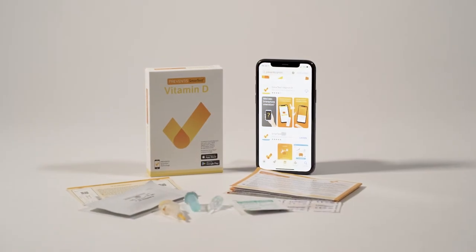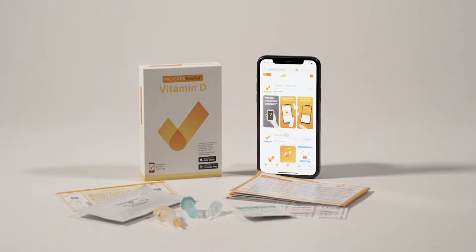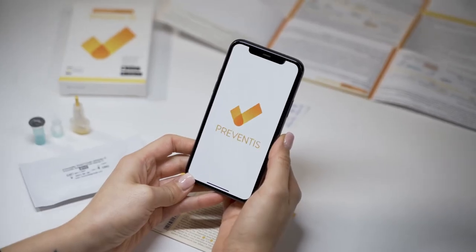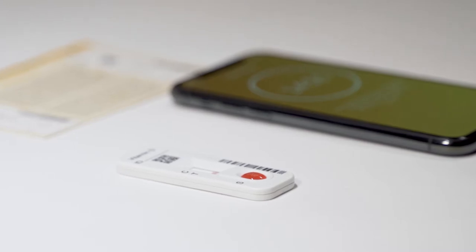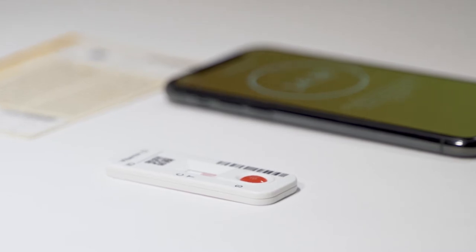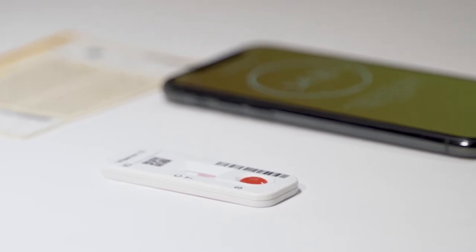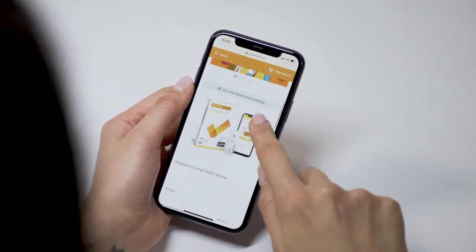In this video we explain how to correctly perform Preventis SmartTest vitamin D. Preventis SmartTest vitamin D consists of a rapid test and a smartphone app that determines the 25 OH vitamin D level from finger stick blood. The measurement range is between 5 and 100 nanograms per milliliter.